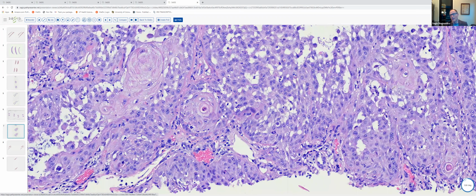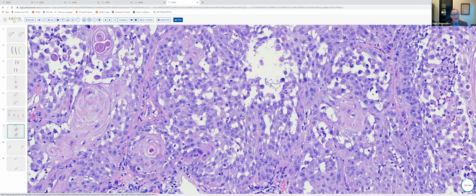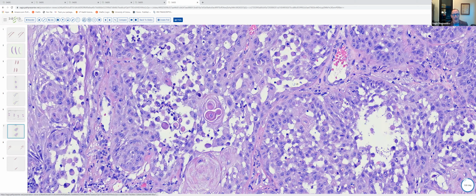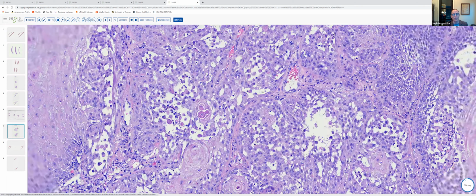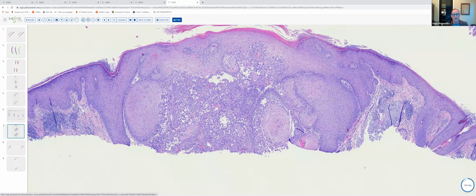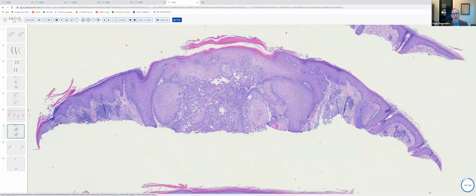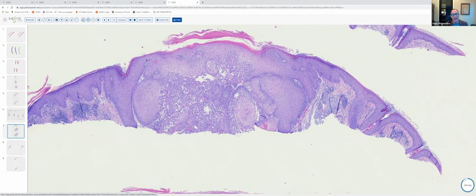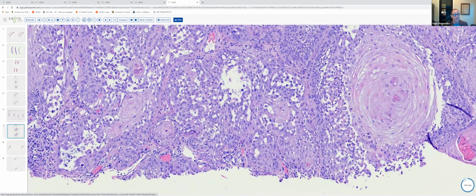Here's a mitotic figure. There are apoptotic cells, but notice that there's also pronounced acantholysis and dyskeratosis. So obviously, acantholytic squamous cell carcinomas will have both acantholysis and frequently dyskeratosis. This doesn't have the nice cystic invagination that we saw with the warty D. And again, the presence of cytologic atypia, especially if there's associated actinic keratosis, is what allows one to distinguish a warty dyskeratoma from acantholytic squamous cell carcinoma. So you're going to have to go down and look at the cytologic features sometimes to distinguish the two.